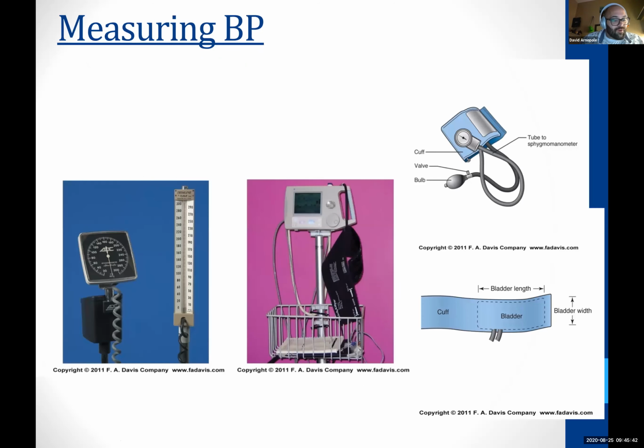There's your machines for it. Now, you've got your automatic, you've got your manuals when we're talking about this. If the automatic is off, again, check a manual. I had a nursing student come up to me and say, "Hey, I checked this patient's blood pressure and it was weird. It was 208 over 140. Isn't that weird? Is that off? Something wrong with 208? What do you guys think? 208 over 140. How do you think I felt?"